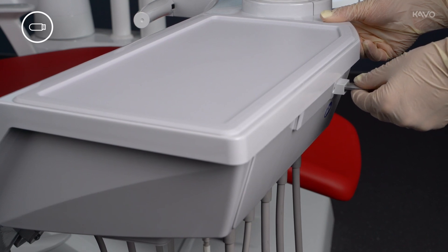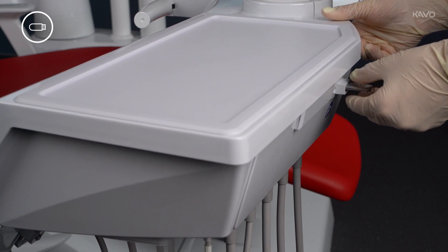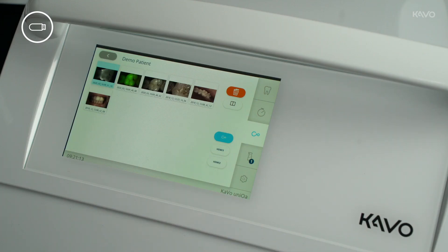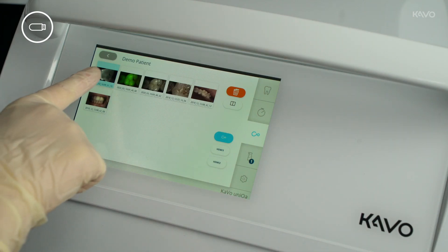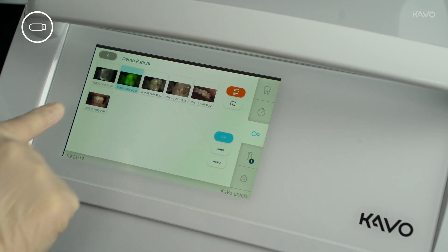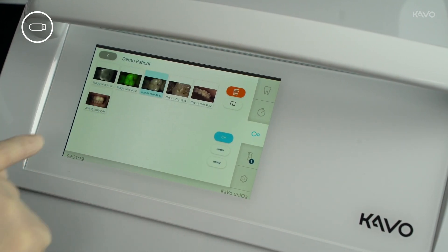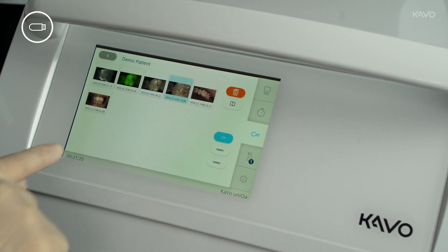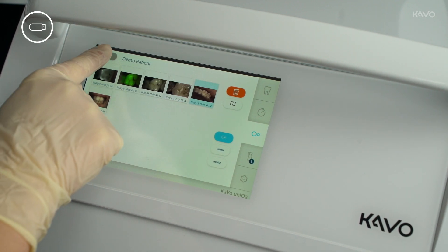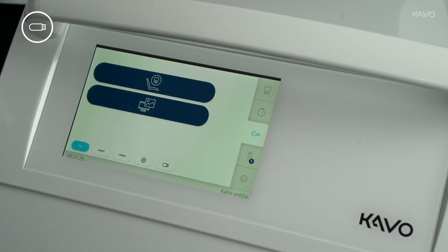To copy the images from the treatment unit to the USB stick, insert the stick into the dentist element on your treatment unit. The USB stick can be inserted before, during, or after the treatment. If USB export is activated, the newly recorded and saved images are automatically copied to the USB stick as soon as a folder is closed.